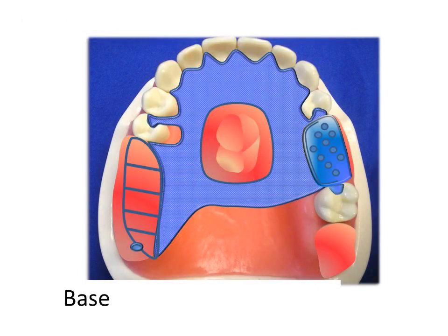Normally, the extension base will have ladder-retained acrylic for a base material. Short, well-healed, tooth-supported areas will have a beaded metal base. Dr. Goon, is there any reason to deviate from this standard? In this case, Marie, based on the scenario, I don't see any reason to change. We weren't given any data on possible space loss which could present a problem. Let's leave it as it is.